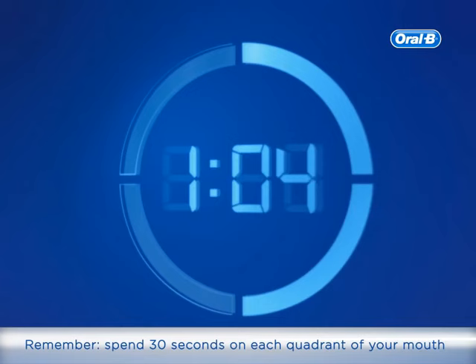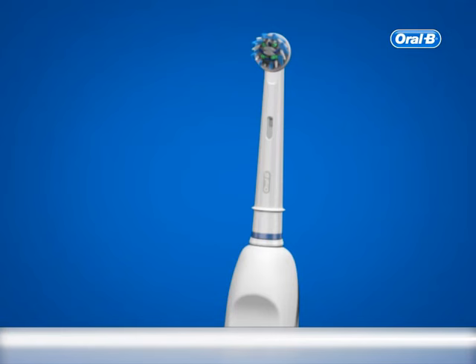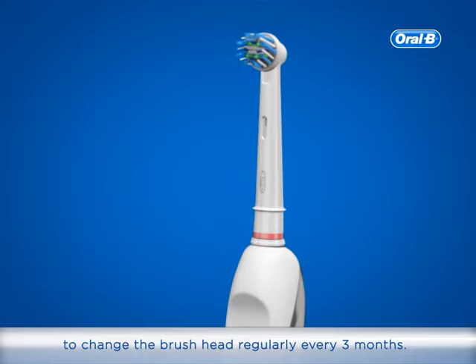Remember, spend 30 seconds on each quadrant of your mouth and brush your teeth at least two minutes, twice a day for the best results. Dental professionals recommend changing the brush head regularly, every three months. Oral-B: the number one brand used by dentists themselves worldwide.